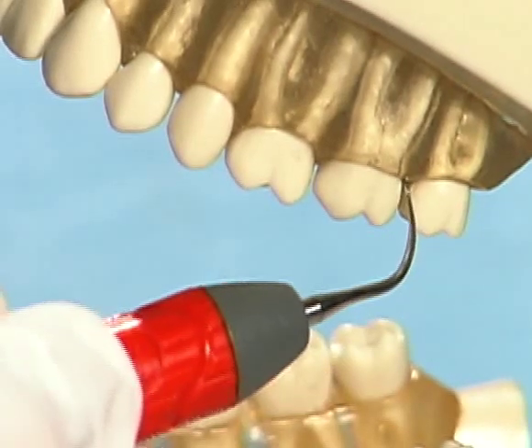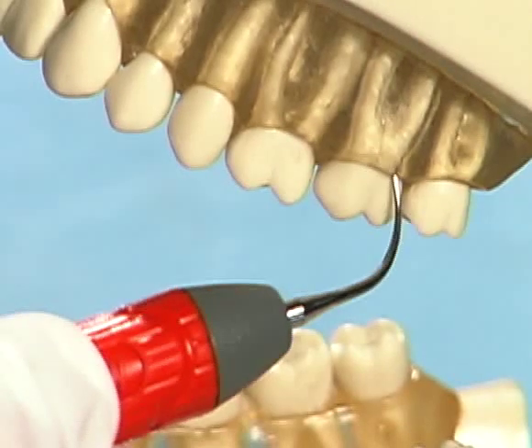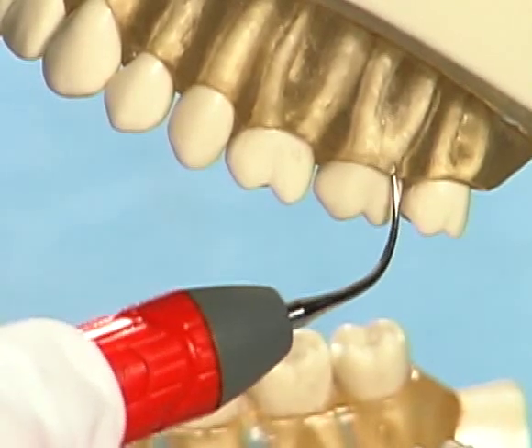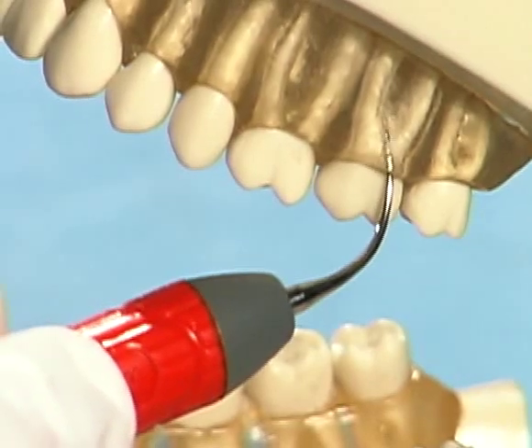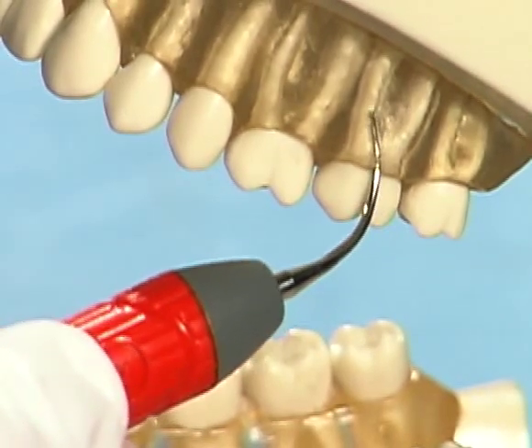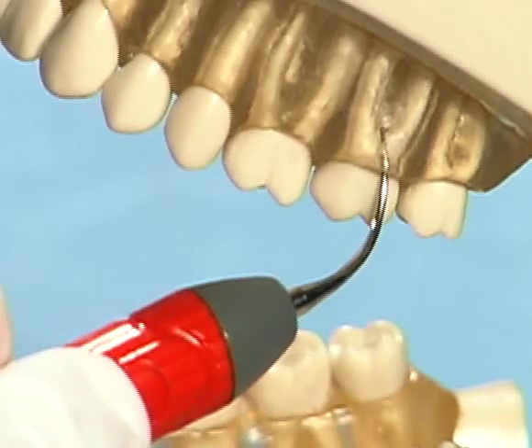The curvature of the right and left after-five insert allows access to posterior interproximal surfaces with concavities, furcations, and tight contacts. Use the tip of the insert to slide into and thoroughly debride furcation areas that are typically difficult to access.